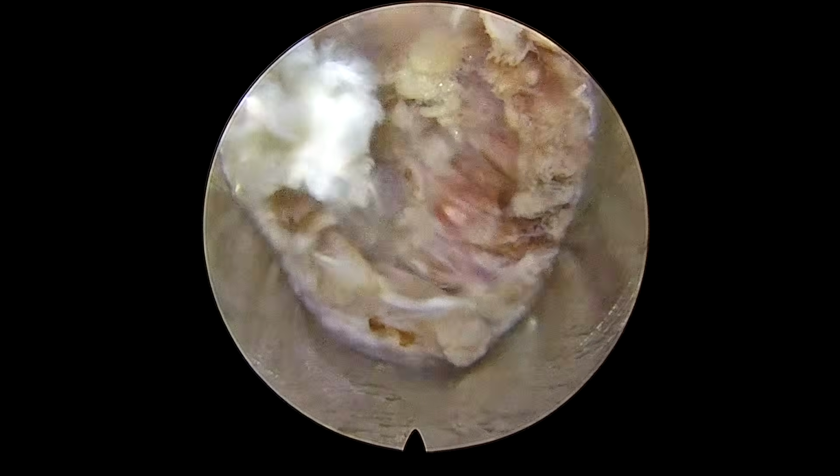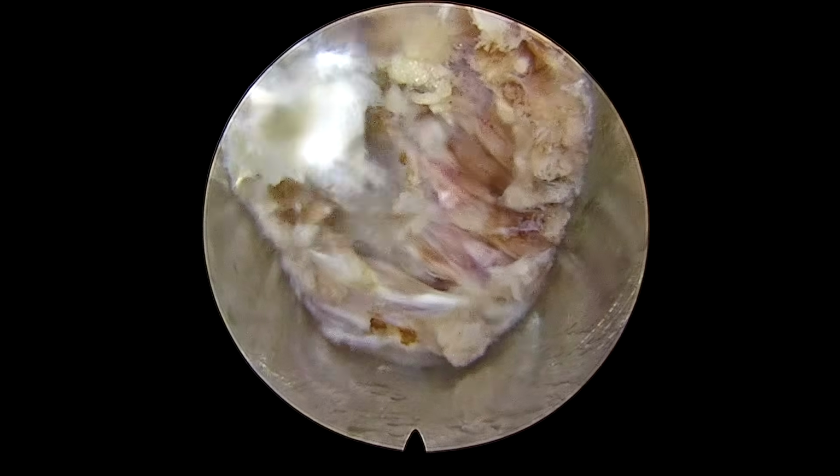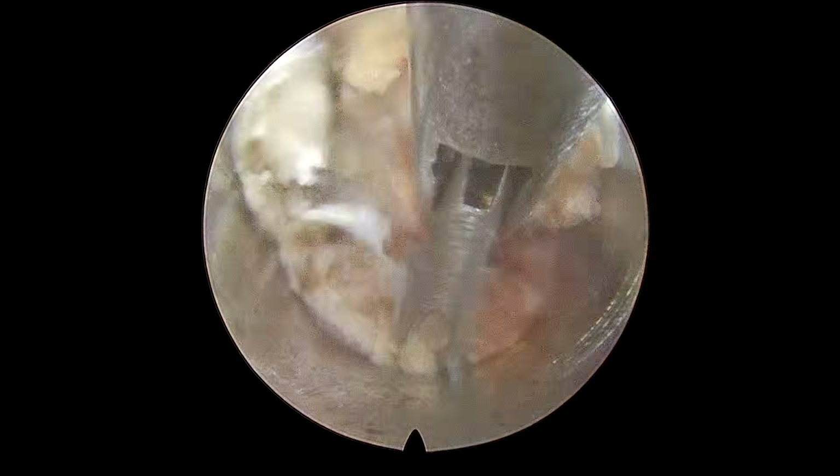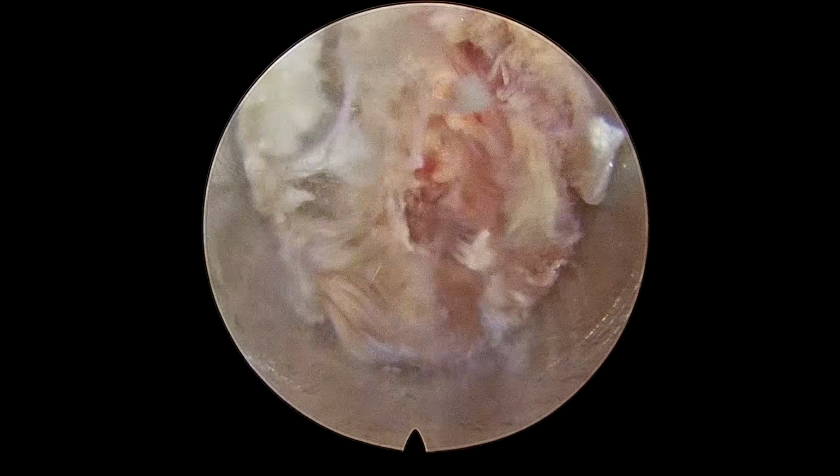So now we are clearing the soft tissues from the interlaminar space, and we are trying to identify the bony landmarks. The most important structure, as you all know, that we try to identify is the V, which is formed by the superior and inferior lamina meeting at the lateral mass.